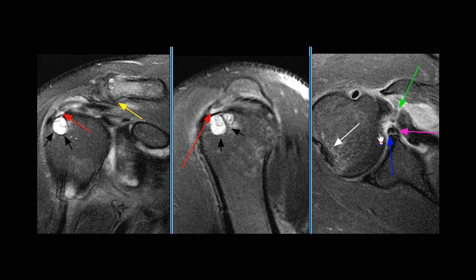A Bankart lesion is seen with an avulsion of the anterior inferior labrum and a small anterior inferior glenoid rim fracture fragment. There is cancellous marrow edema in the posterolateral humeral head consistent with a Hill-Sachs lesion.